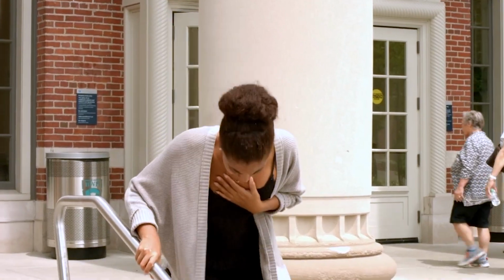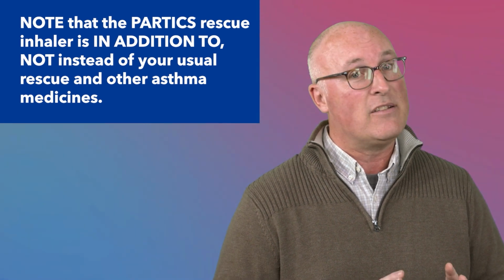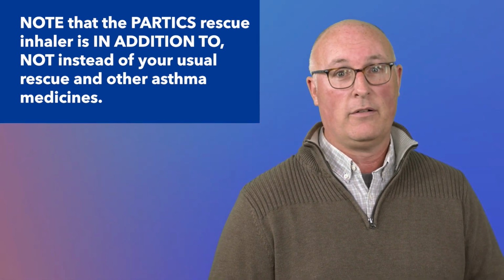If you have problems with your asthma during the study, like having to go to the emergency room or hospital, or having a worsening of your asthma, we may call you to ask some extra questions. As a safety point, remember, if you've had to use your quick relief medicines hourly or more frequently for 2 to 3 hours in a row, or if at any point you are unable to speak in full sentences, unable to lie down flat, or having lots of trouble breathing, seek medical help immediately or call 911. Remember, the additional PARTICS inhaler is not a substitute for your quick reliever.